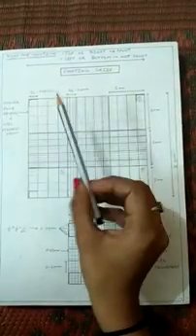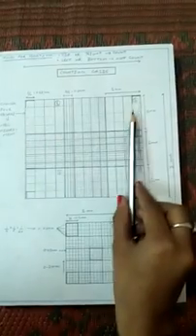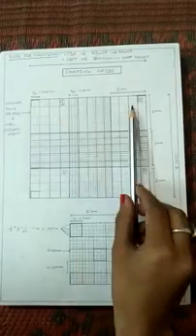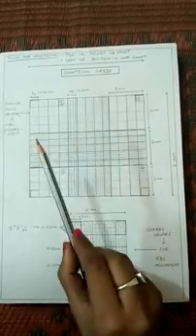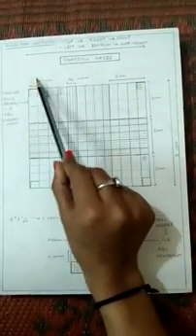So where do we count WBCs and where do we count RBCs in this diagram? Friends, the first, third, seventh and ninth, or we can say the corner big squares are used to measure WBCs in blood, and the middle central big square is used to measure RBCs. So friends, these four corner squares are used to measure WBCs, and this middle one is used to measure RBCs in human blood.